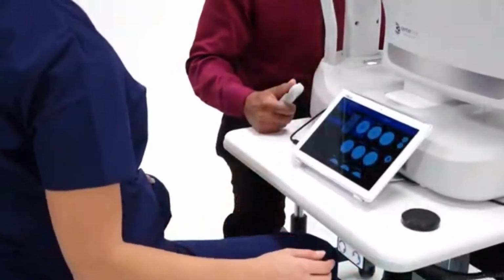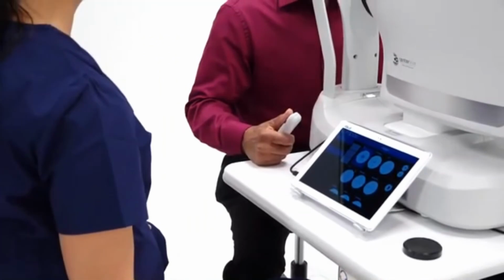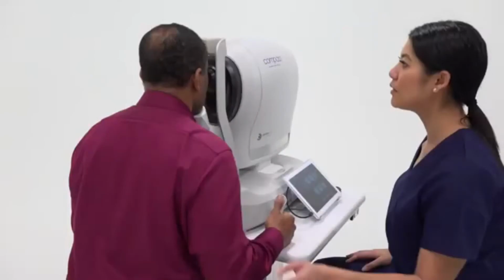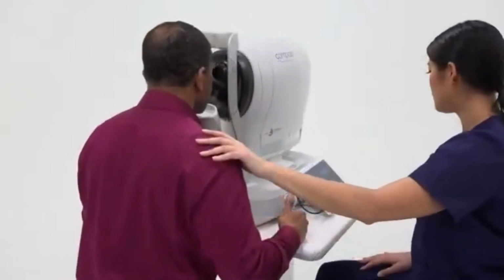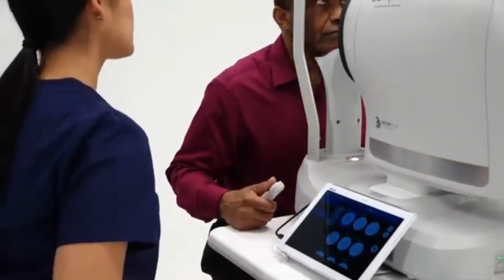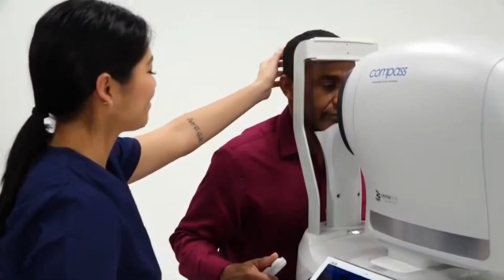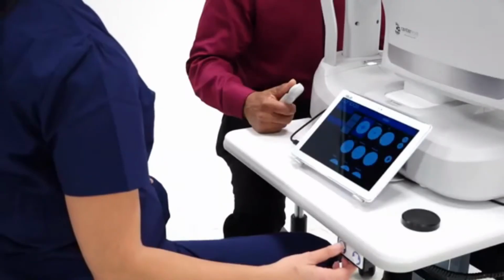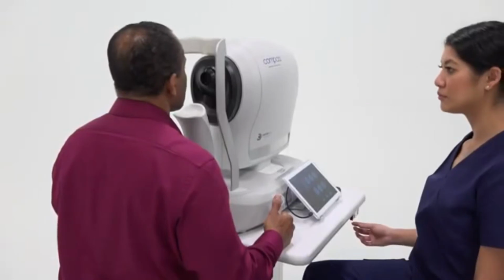It is now time to properly position the patient. Be sure to place their chin forward in the chin rest and their forehead all the way forward into the headrest. The chin rest height is adjusted using the up-down buttons on the tablet. Align the center of the patient's pupil to the etching in the headrest. It is important to adjust both the table height and possibly the chair height, if necessary, to ensure patient comfort.